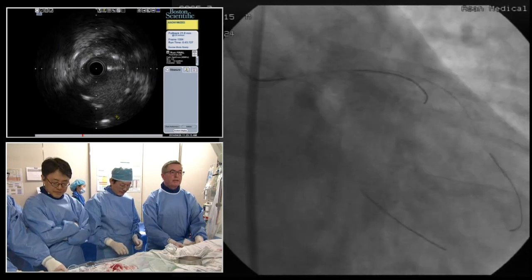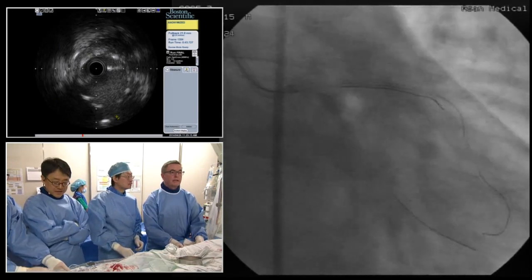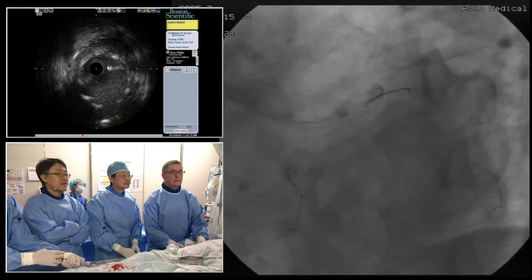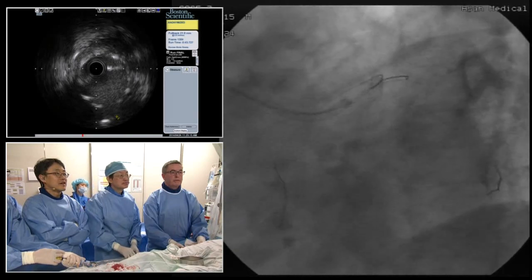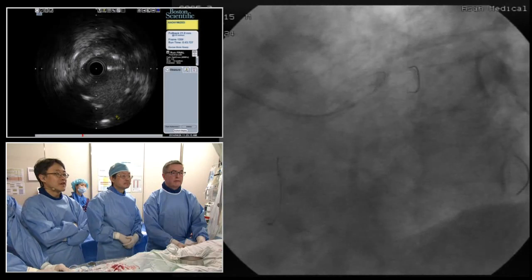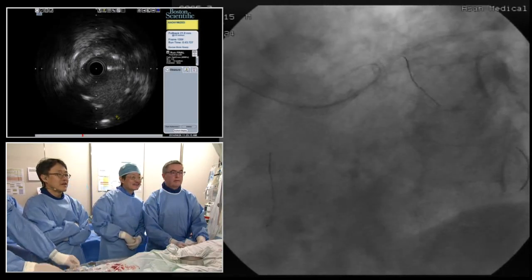I think it's going to quickly become two stents for some. No, I don't think I would consider putting a second stent in, but I think I would consider looking at it by IVUS. We could do that. It's a large vessel. There was a lot of plaque heterogeneity in the LAD that looked to be more unstable. It looked a little bit hazy in that last left caudal view. Okay, perfect.